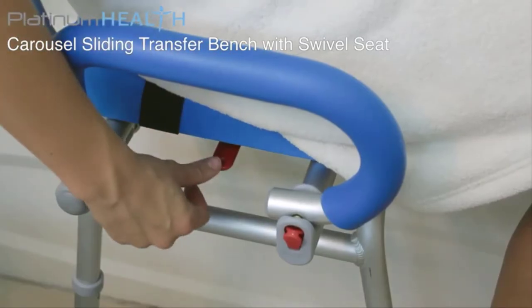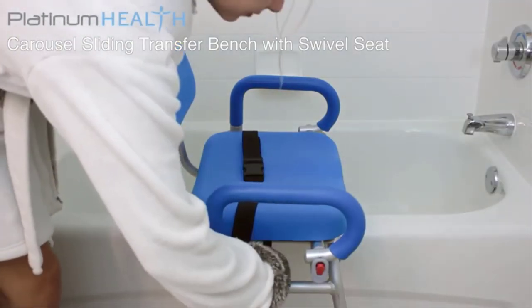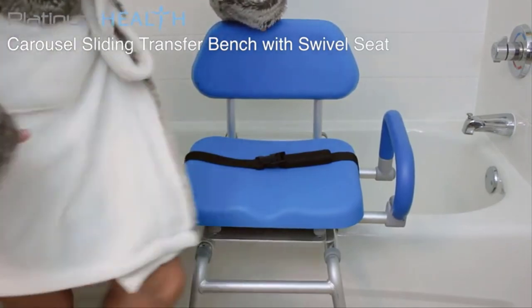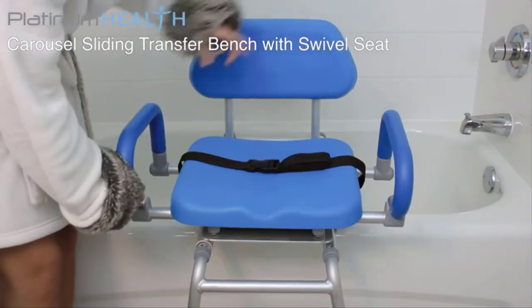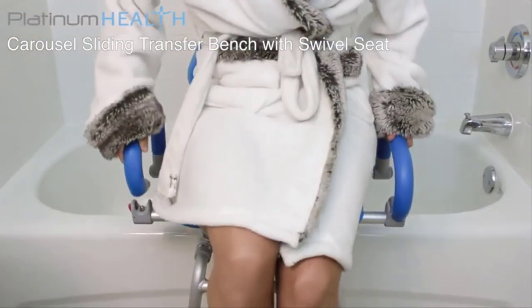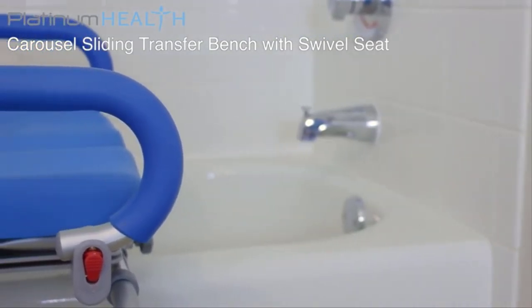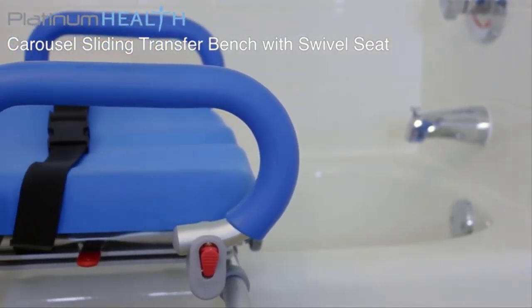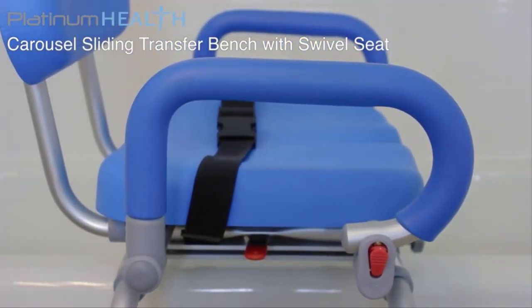Once installed, operating the Carousel is simple and intuitive. To transfer into a tub or shower, simply rotate the seat so that it is facing into the room and sit normally. For easier transfers, the pivoting armrests can be raised then locked back into place. The padded armrests also provide a solid leverage point to assist users to and from the seated position.